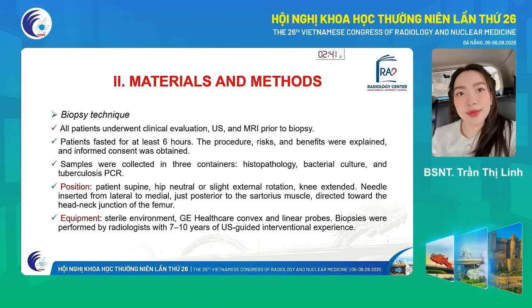About the biopsy technique, all patients underwent clinical evaluation, ultrasound, and MRI prior to biopsy. Patients fasted for at least 6 hours. The procedure, risks, and benefits were explained, and informed consent was obtained. Samples were collected in 3 containers: histopathology, bacterial culture, and tuberculosis PCR.